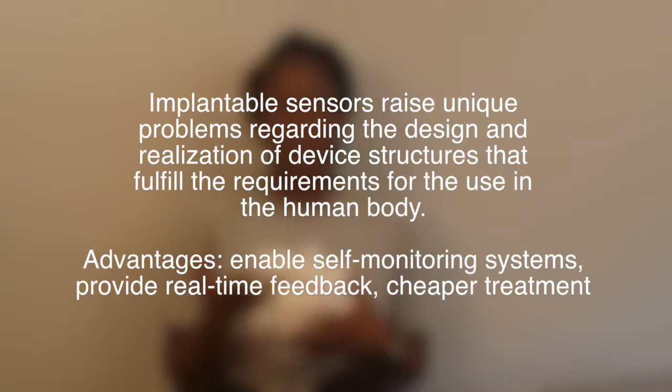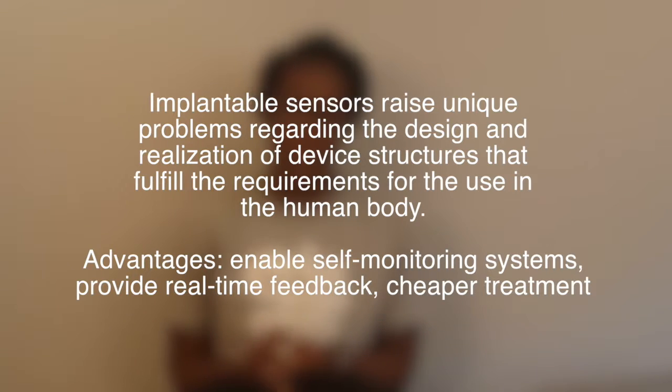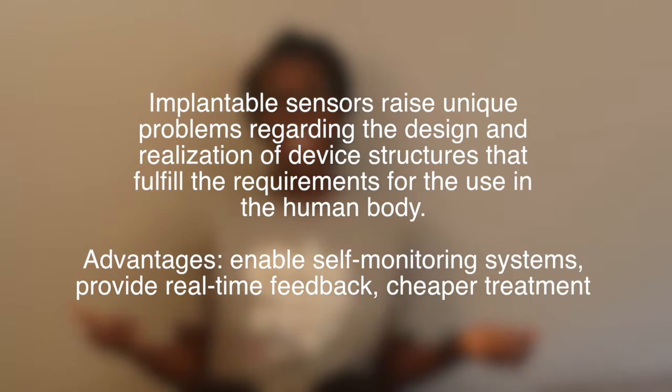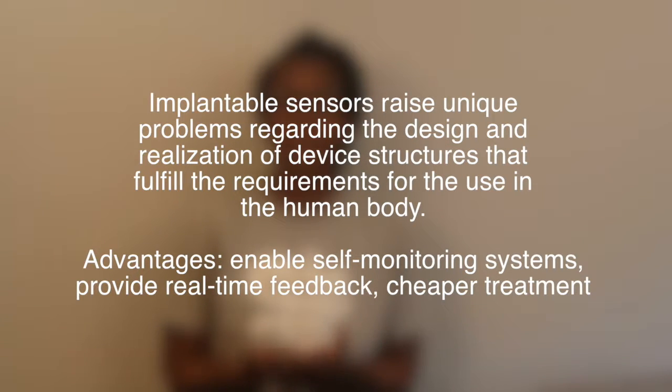Now, some of the advantages to using these implantable sensors is that they enable self-monitoring systems. They provide real-time feedback, and treatment is quite cheaper. So in this chapter, we will describe implantable molecular sensors and the different related devices.